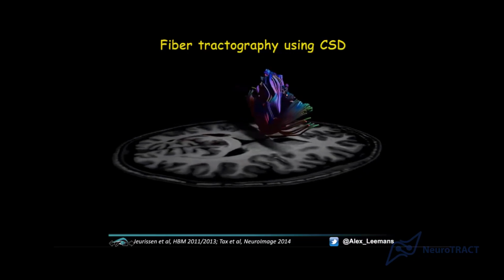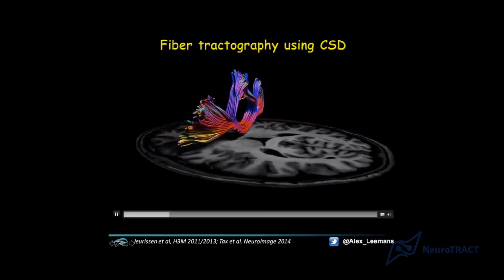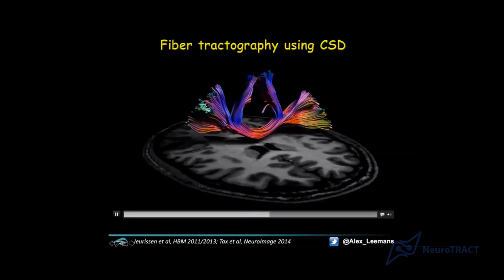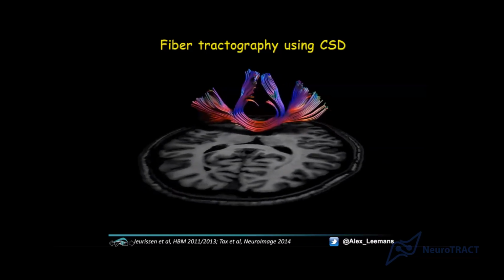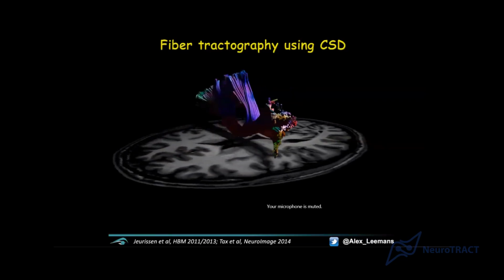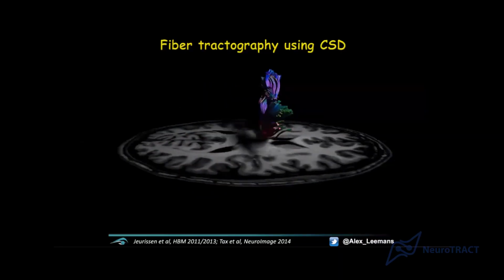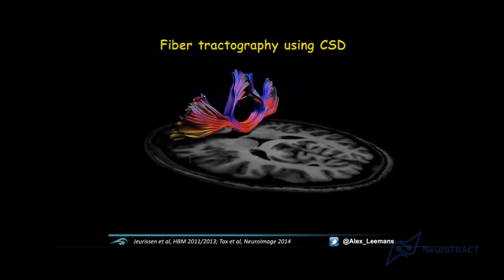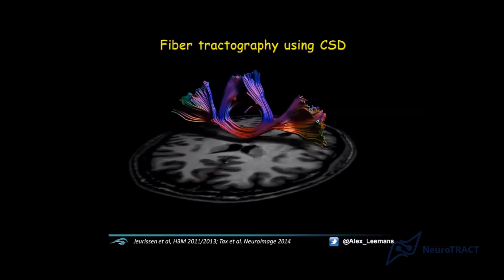And the second thing I really like about this is this image. If you know about the hand knob in the motor cortex, this omega shape, you can actually see the omega here as well. And it goes to the homologous other side. So the other side is like the mirroring of that cortex. So what I'm showing you here is probably the connections responsible for coordinating opening and closing buttons of a shirt, because they need to work together. They probably need to feel each other, or get an idea of how far they are apart or something like that.